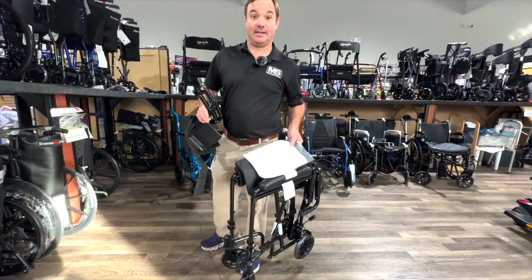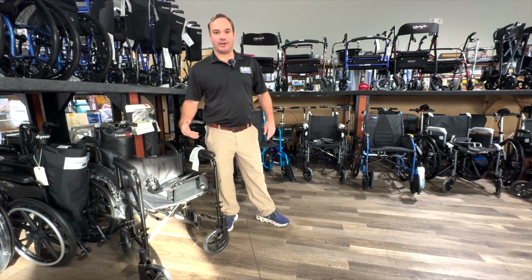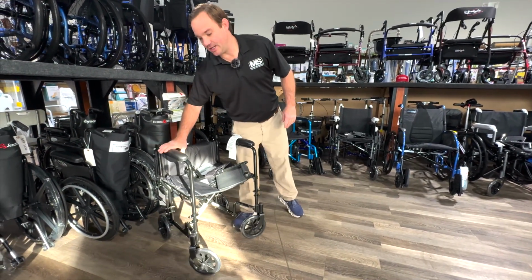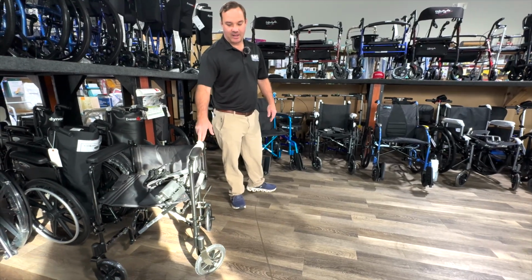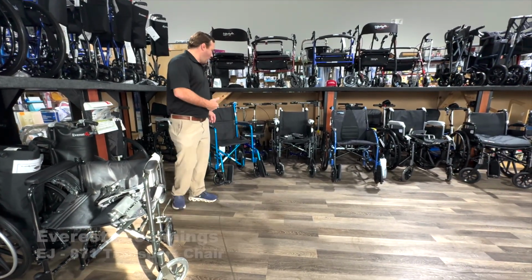Now you can buy these in steel, so be careful. This is aluminum. It's going to be lighter than steel. Just kind of remember that. This is made by Everest & Jennings, so it's a Graham-Field product. This is kind of what we've stocked in here for a long time, but there's other brands out there you can see.